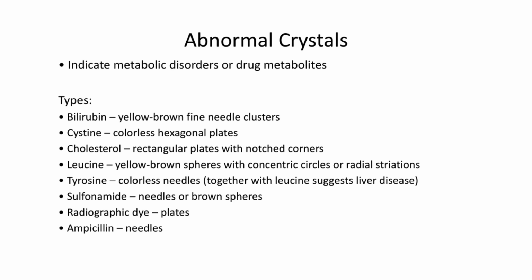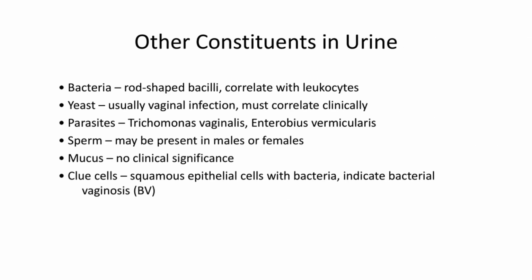Sulfonamide drugs may form needles or brown spheres. Radiographic dye can precipitate as plates, and ampicillin may crystallize as needles. Bacteria, particularly rod-shaped bacilli, are the most commonly seen organisms and should be correlated with leukocytes.